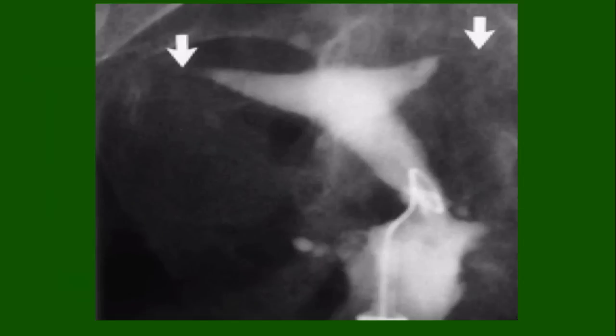Here we see a patient who has bilateral proximal tubal occlusion as identified by the arrows. The uterus is normal in its shape and contour, but no dye is seen getting into the fallopian tubes. Our last image is of a woman who had pelvic inflammatory disease and now has bilateral hydrosalpinx, as seen by the very large dilation of the ampullary portions of the fallopian tube on each side. This is a common cause for tubal infertility.